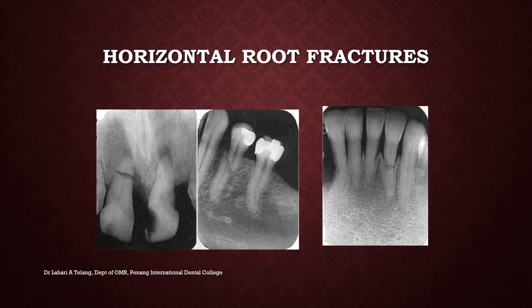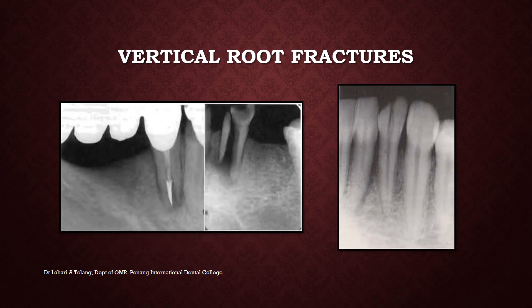This is an example of horizontal root fractures. You can see a middle-third fracture, an oblique fracture which is also considered a horizontal fracture, and again a middle-third fracture of the root. Vertical fractures have poor prognosis. These can occur due to significant stress in load-bearing teeth and root canal treated teeth. This shows a vertical fracture of the entire root, and this is a crown-root vertical fracture.